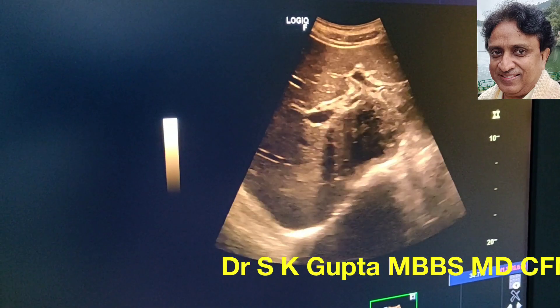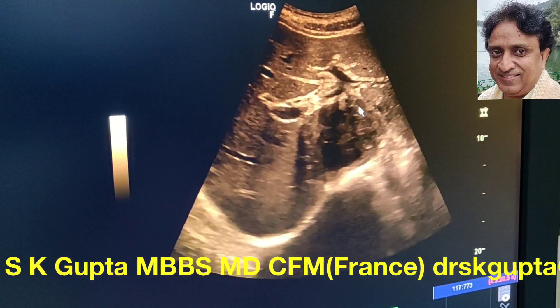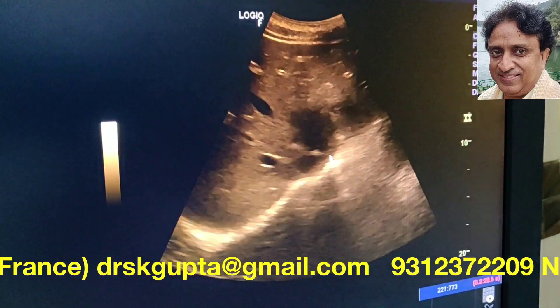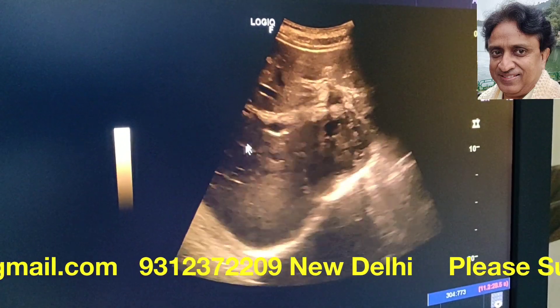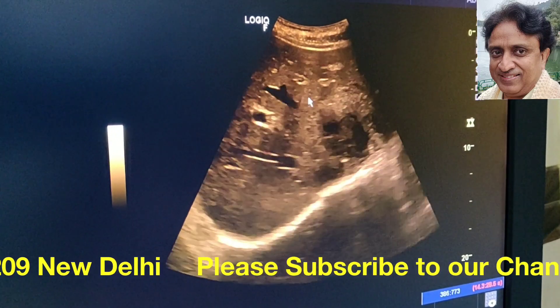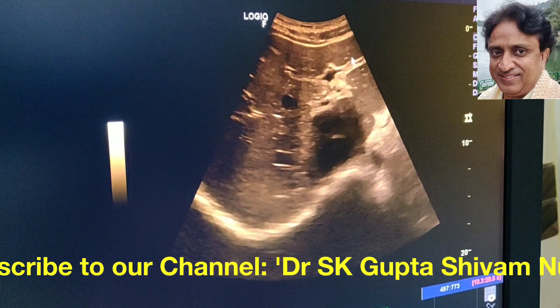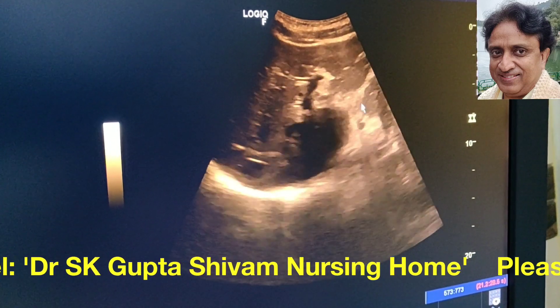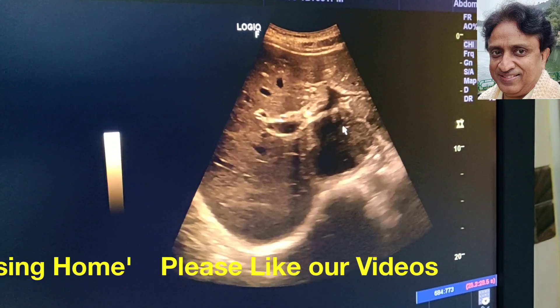This patient eventually got better on medical treatment and did not need drainage. This is another important case — it could have been overlooked. You can see decreased echogenicity of the liver and findings that might suggest acute hepatitis without liver abscess, highlighting the importance of careful examination.